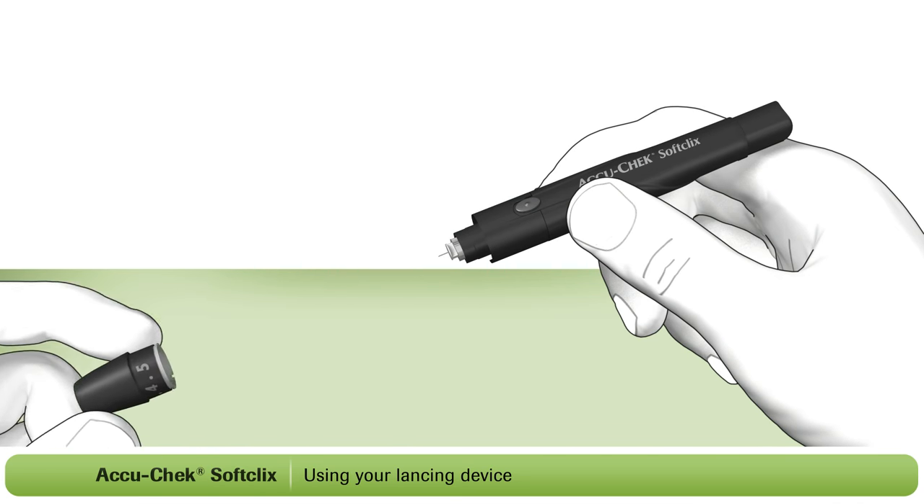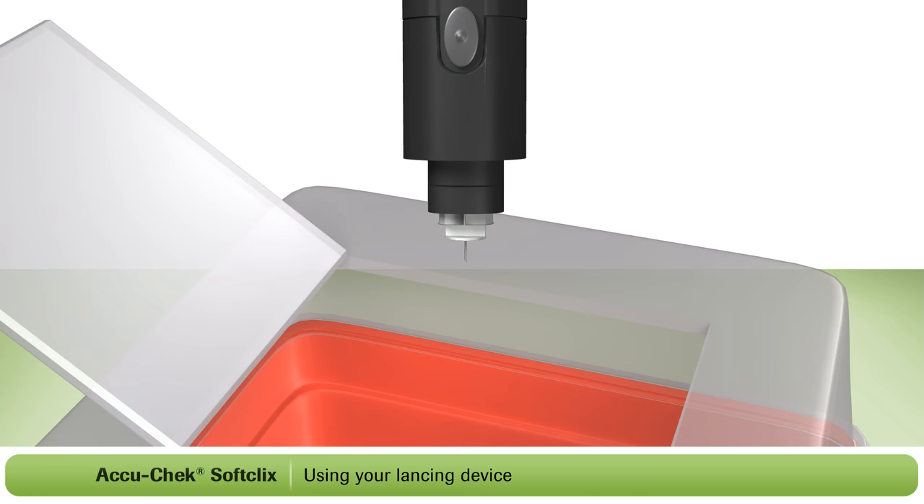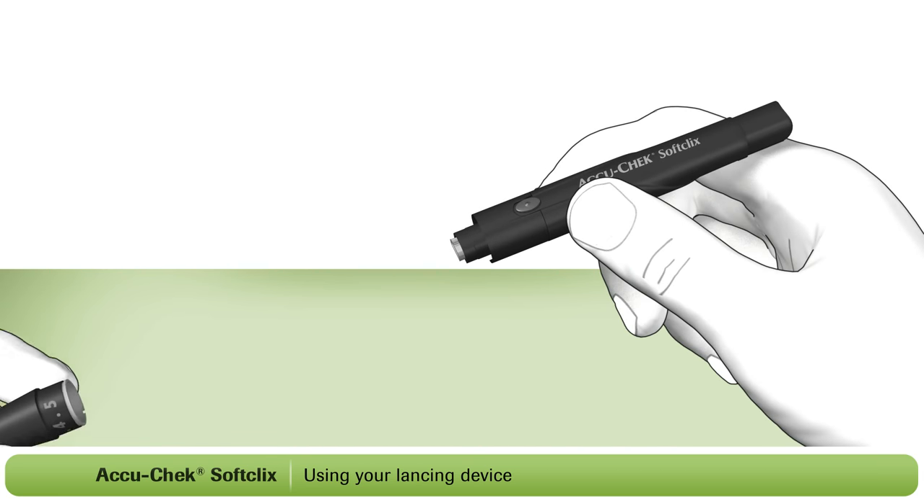To dispose of the lancet, remove the cap from the lancing device. Point the lancing device into the sharps container and eject the lancet by sliding the ejector forward as shown. Then place the cap back on the lancing device.